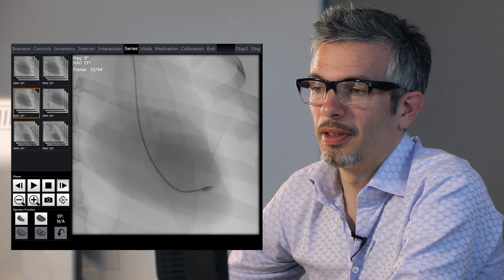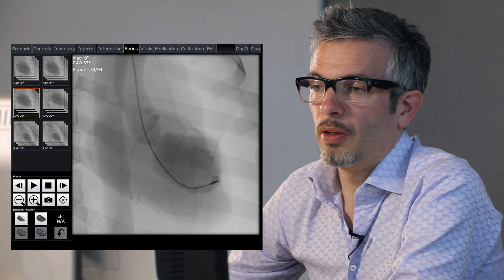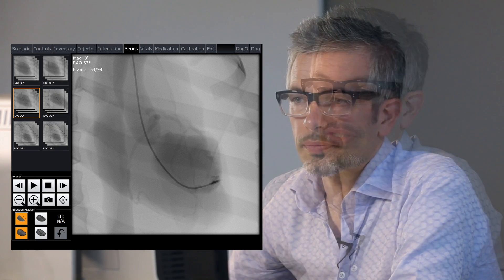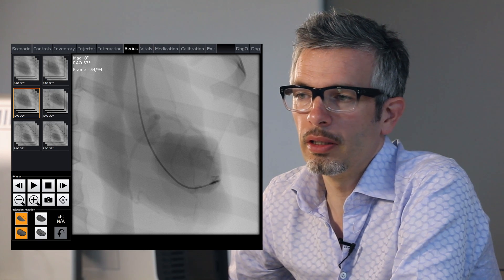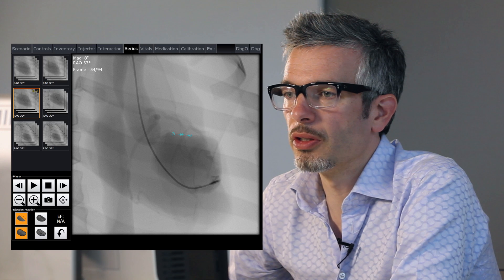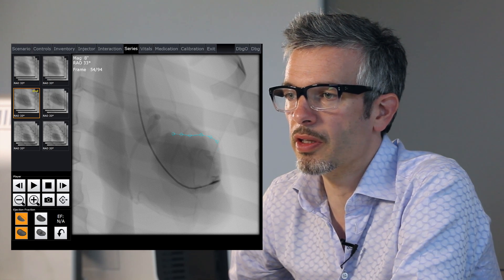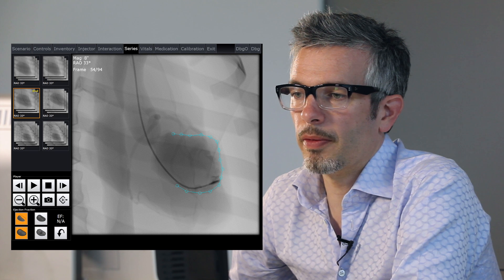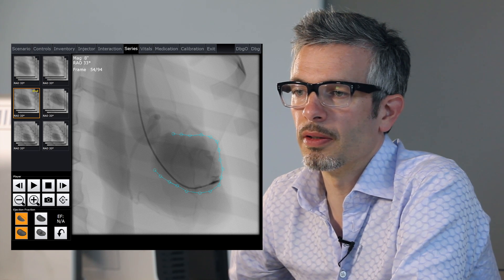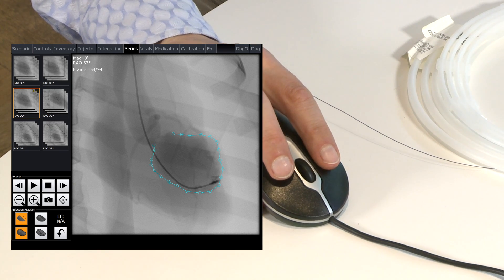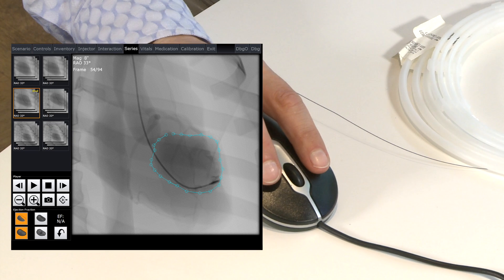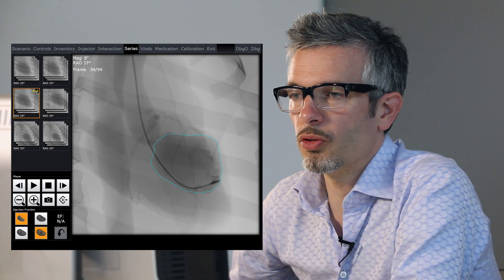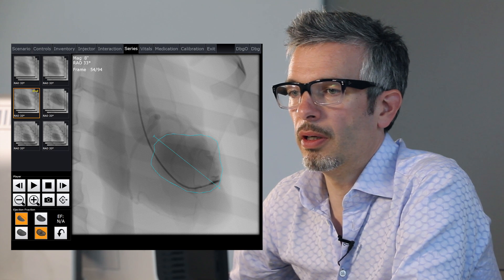We'll just flick through those again — it's quite a long loop. So I think that's where we had our smaller size. We click on this and use this tool here to click around the margins of the left ventricle. This is a sort of aneurysmal segment just there. The closer these points are together, obviously the more accurate it is. Coming across the mitral valve here and across the aortic valve, and you end by double-clicking in the first circle that you've drawn.